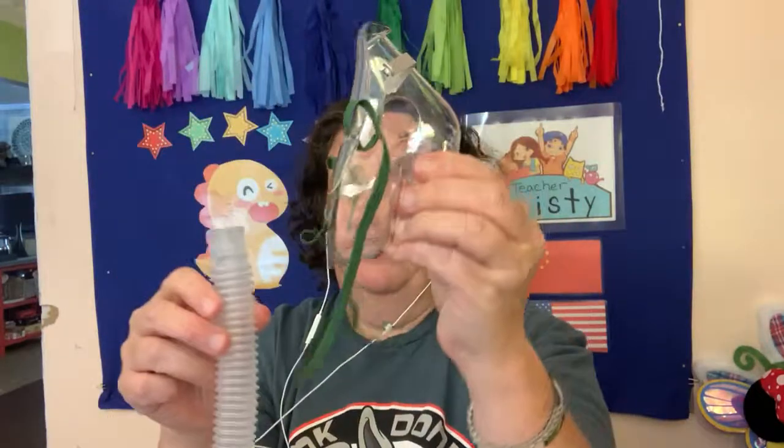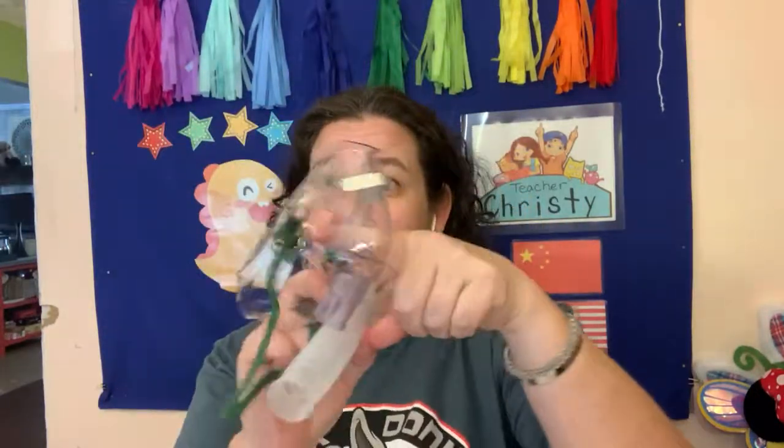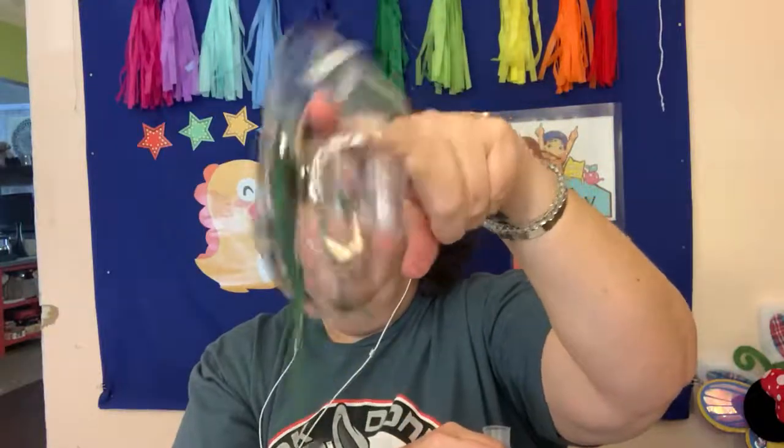But for this device, you have a whole bunch of parts. You have an aerosol mask, not a simple mask because your finger goes through it. A simple mask doesn't let you do fancy things with it. It's simple, very, very simple. This mask is the aerosol mask, and when aerosol's coming through it, it looks like you're steaming, or it's not simple because you can make it into other things. That's how I remember it.